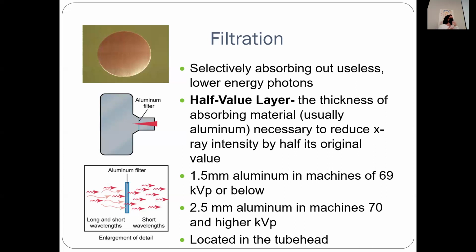So you might be like, why would I want to reduce the intensity? Don't I want higher penetrating, better? Why would I want to reduce it? But really what you're doing is you're reducing the unneeded wavelengths. It's not so much that you're taking away half of the good ones, you're just taking away the unnecessary ones that don't really give you any benefit. So important, you can star this here.